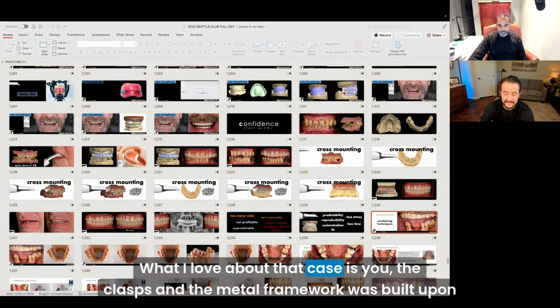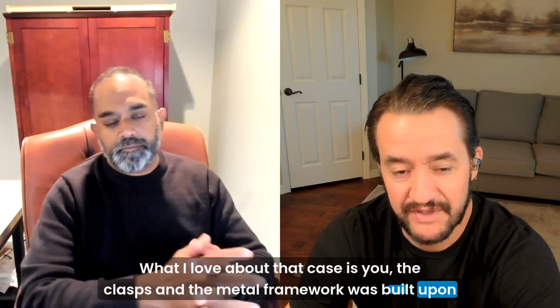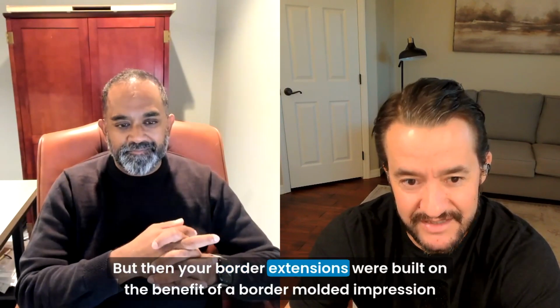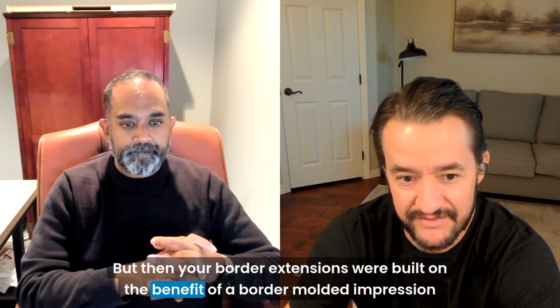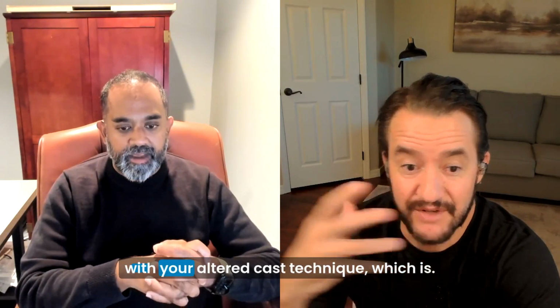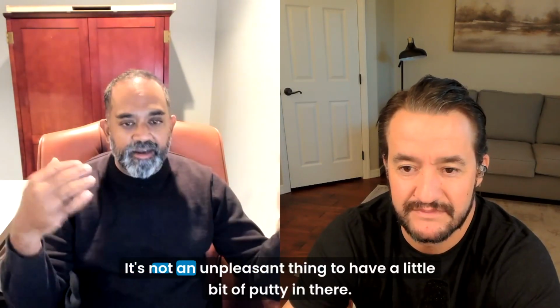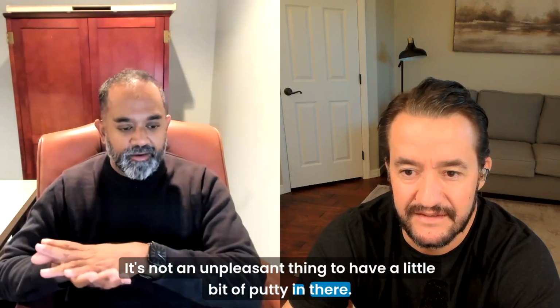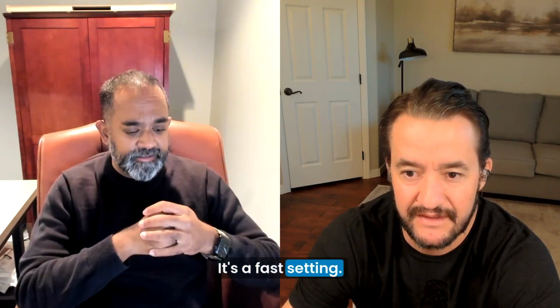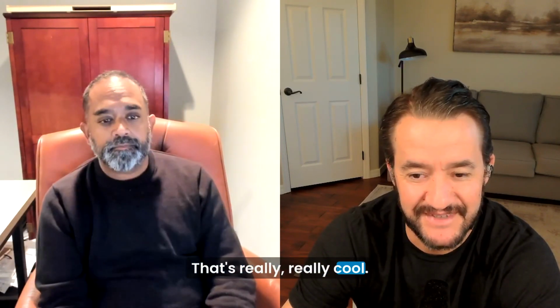What I love about that case is the clasps and the metal framework were built upon the accuracy of an intraoral scan. Exactly. But then your border extensions were built on the benefit of a border molded impression with your altered cast technique, which is very easy for the patient. It's not an unpleasant thing to have a little bit of putty in there, and it was in there for maybe 45 seconds or a minute or so. It's fast setting, so easy stuff. That's really cool.